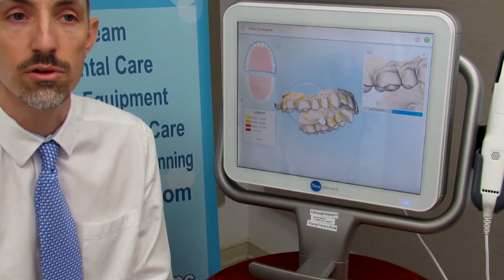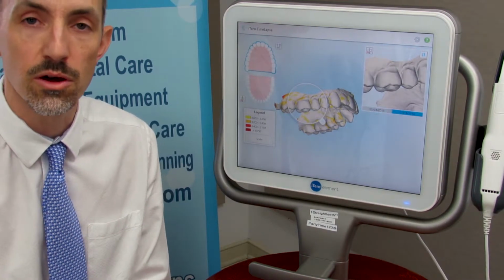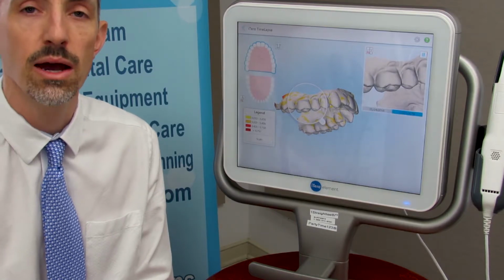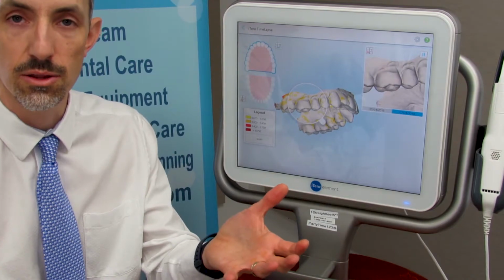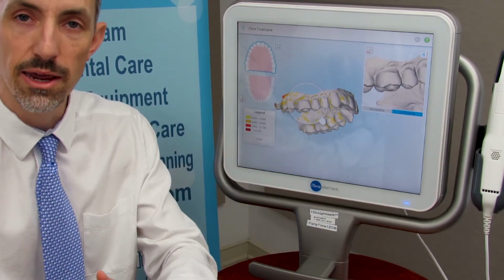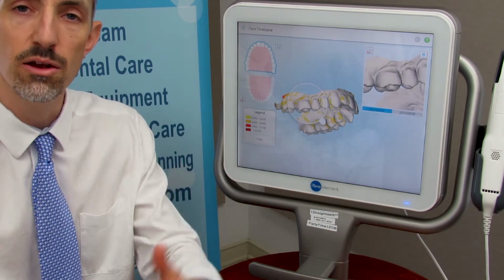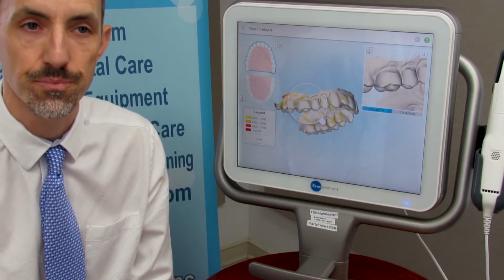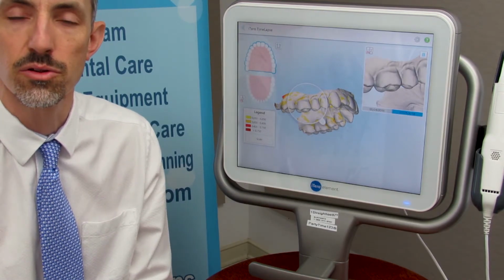That's a wonderful advantage. Another advantage is that you have the ability to do what we call a smile donation. If you have a relative that you like their teeth, you can scan their teeth. We can copy and paste their teeth, and when we make final crowns for you, make them match their teeth. So those are some of the beginning advantages of the digital information.